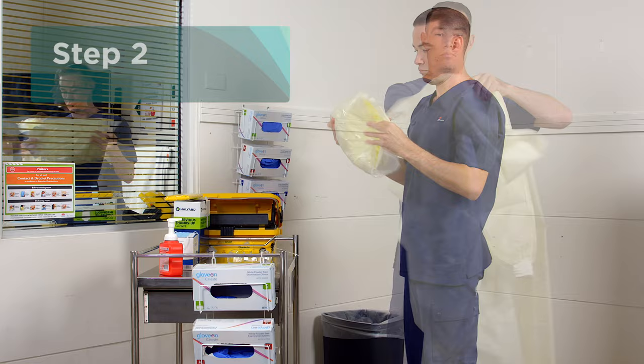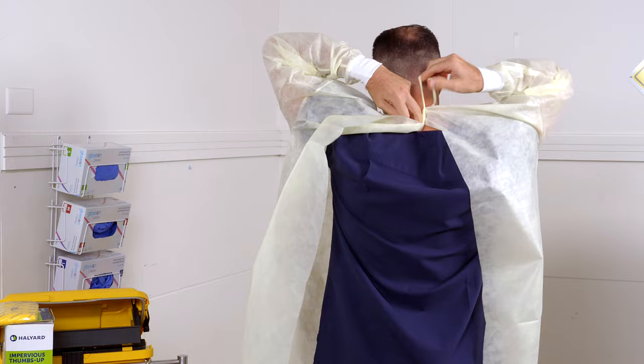The next step is to put on an impervious gown. Secure the gown at the back behind your neck and around your waist.